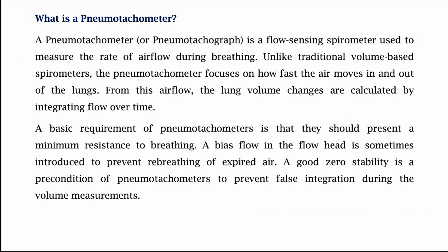Earlier, what were we doing? What is the difference between this and the spirometer? Well, with the spirometers, we discussed the critical volumes. Recall, what are the volumes that we discussed? We looked at tidal volume, inspiratory reserve volume, expiratory reserve volume, residual volume, and capacities. We looked at those things. But here we look at flow.